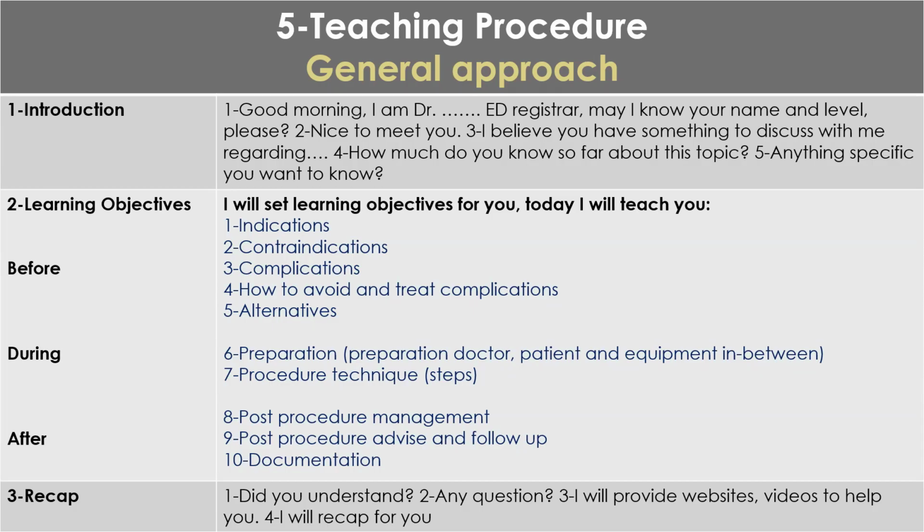In terms of complications, sometimes urethral ruptures happen in catheter passage. To avoid that, you want to make sure that you're passing the catheter in fully before you inflate the balloon. So you want to pass it up to the flange before you inflate the balloon. Treating the complications, most of the time you need to involve urologists, the specialists, because they've got their ways to maneuver that. In terms of alternatives to passing urethral catheters, sometimes there's a more invasive technique called suprapubic catheterization. Again, urologists would, most of the time, handle that on their own.